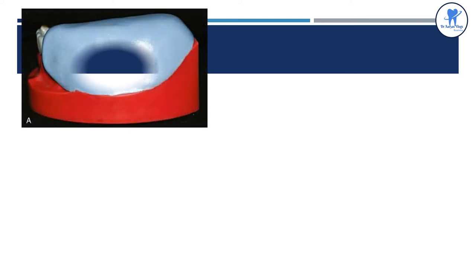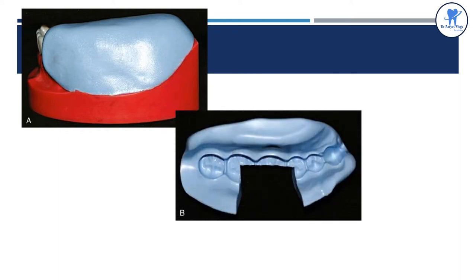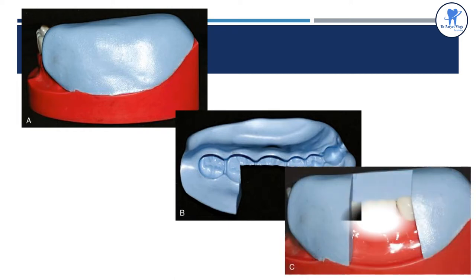Before the preparation has begun, we have to make a putty index for the verification of the preparation. This shows the adaptation of putty for the index. This is the cut putty index along the incisal or occlusal edges, and here it is the verification of the preparation with the use of the index.